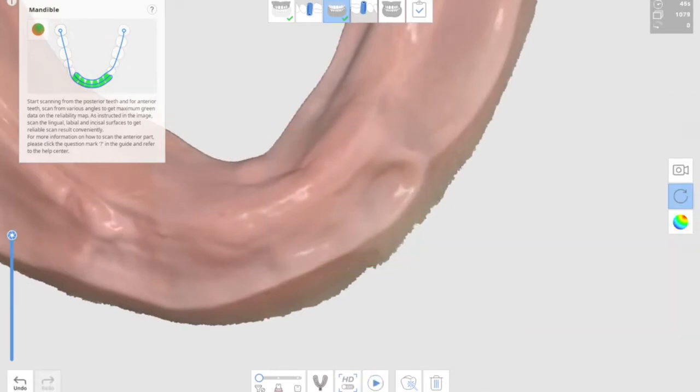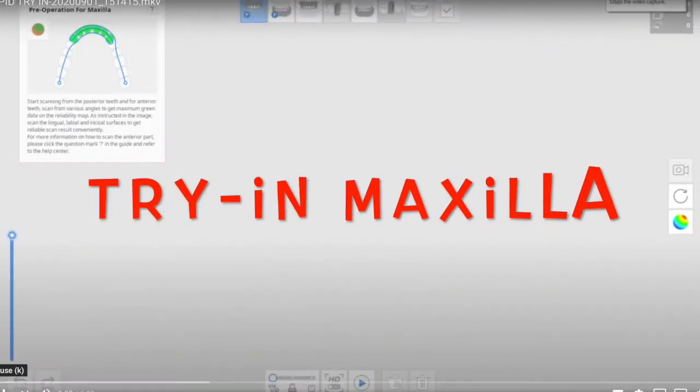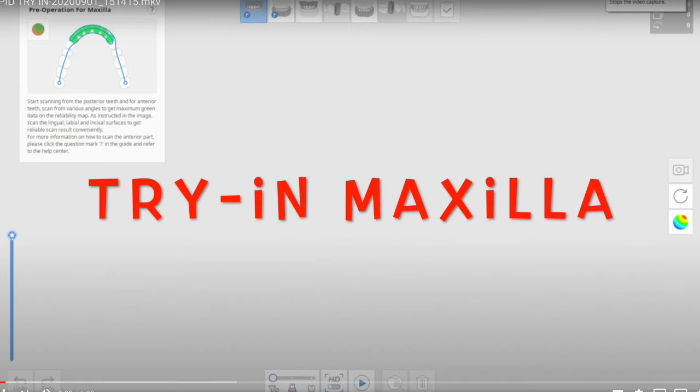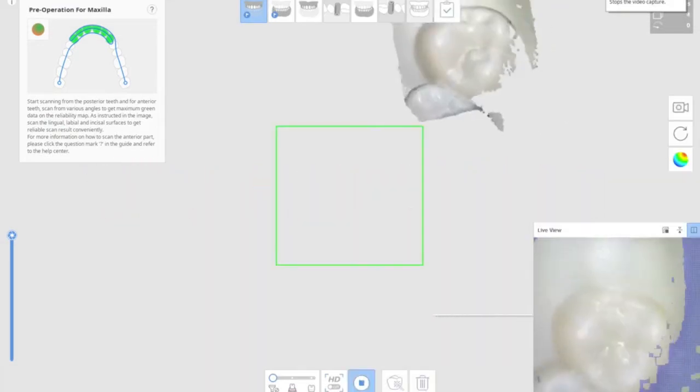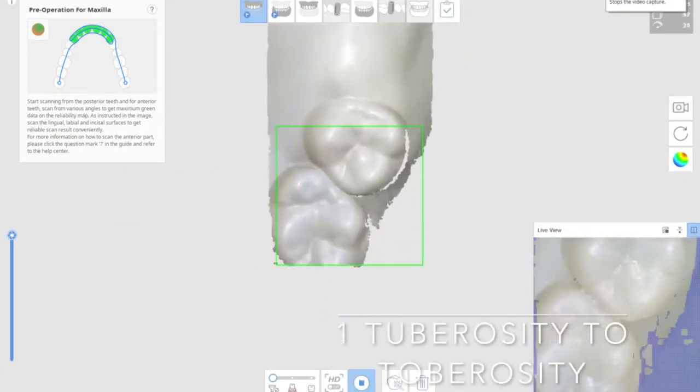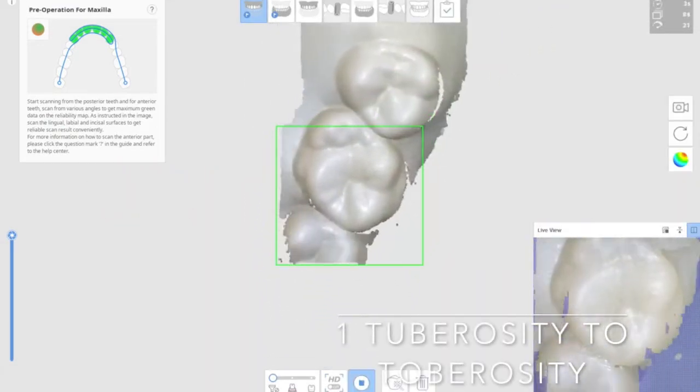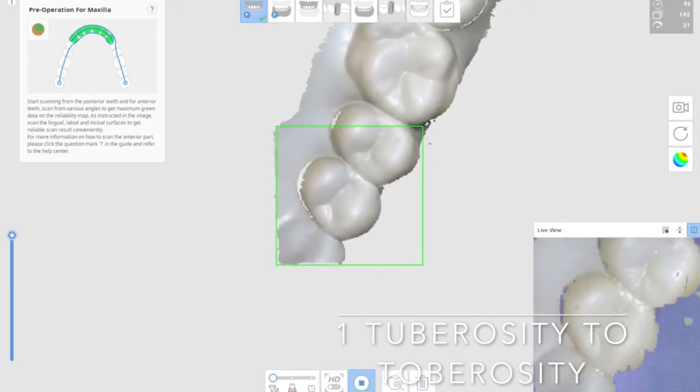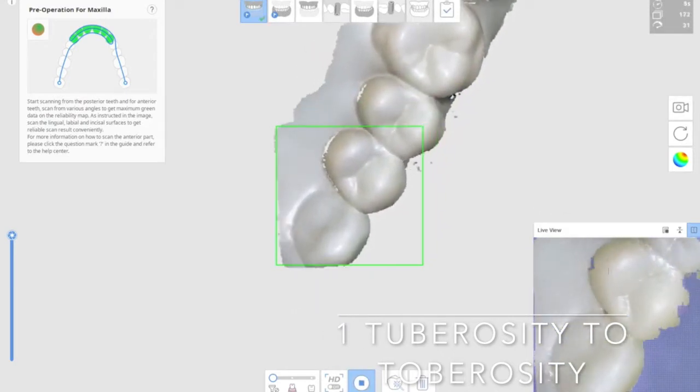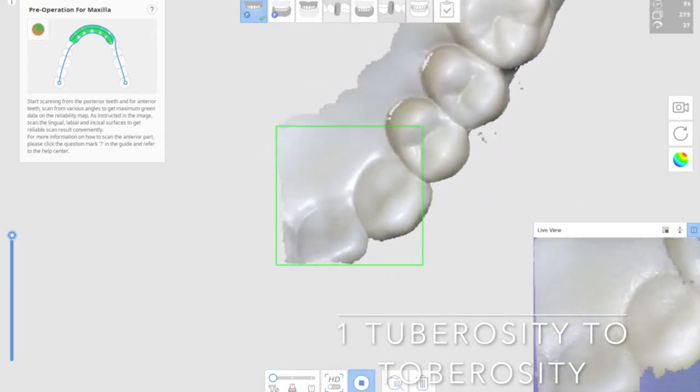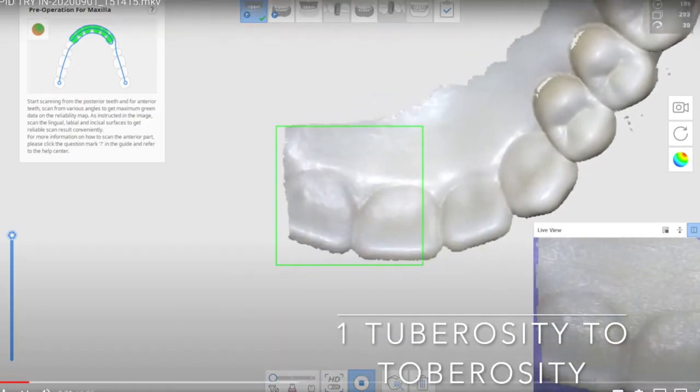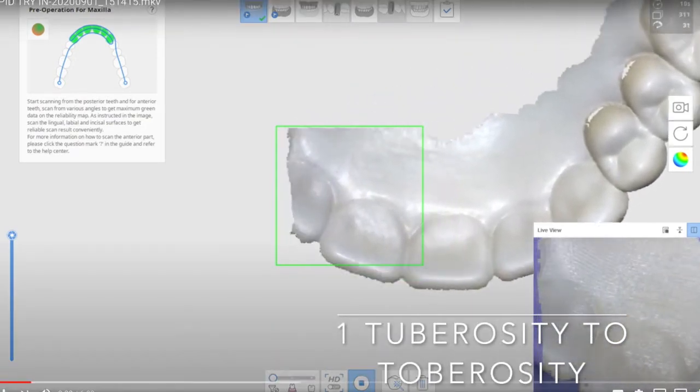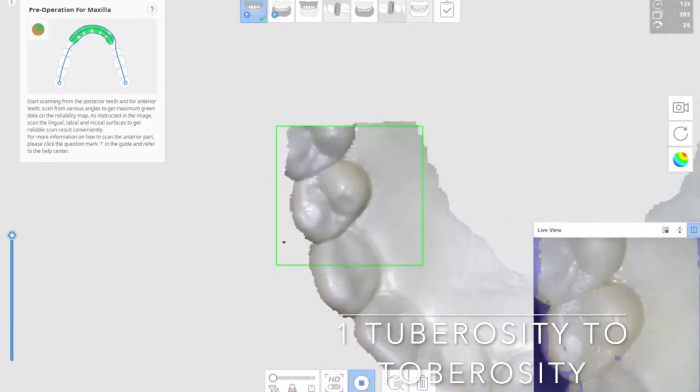Then we're going to move on to how to scan edentulous try-in denture. First, the maxilla. It's always a start from tuberosity when you're scanning maxilla. And try-in will have teeth, so scan the teeth from one side to the other tuberosity.